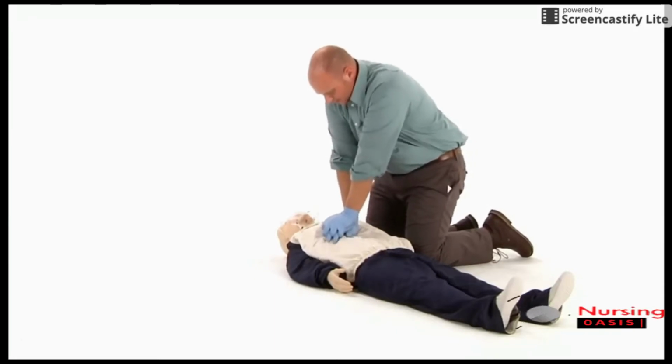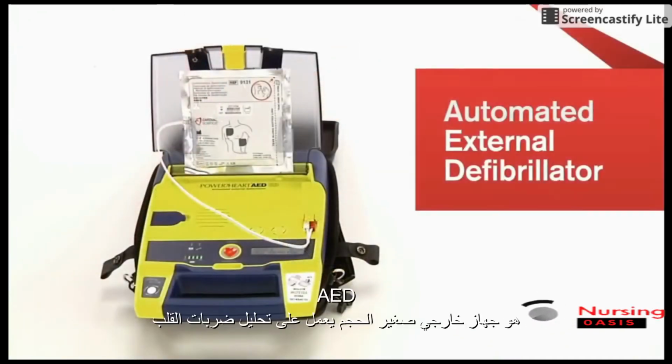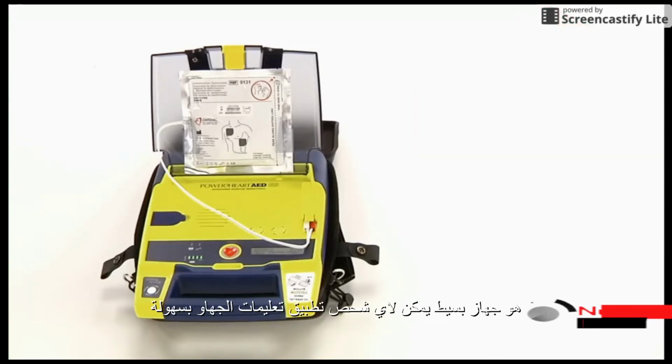Continue CPR until an AED is ready to use. Got the AED. 14, 15. An AED, or automated external defibrillator, is a portable electronic device that analyzes the heart's rhythm and determines if an electrical shock is needed to help the heart restore an effective rhythm. Most AEDs can be operated by following these general instructions.